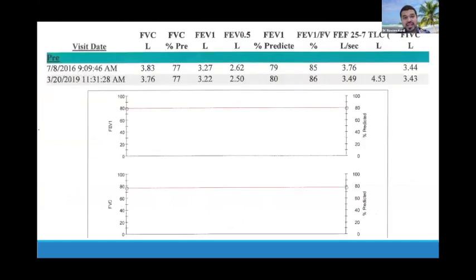And then the most important thing, lastly, clinically, that you need to look at is the pattern, yes? So I did the test in 2016 and 2019, almost exact the same numbers, exact same percentage. So you'll see, it looks like a flat line even. It's the same, nothing happened in 2+ years. So that's what you think about.